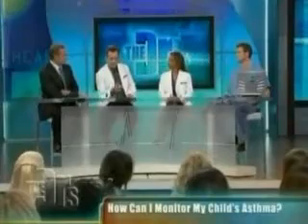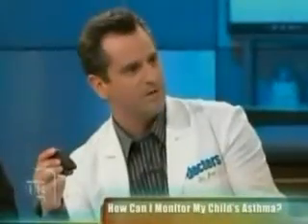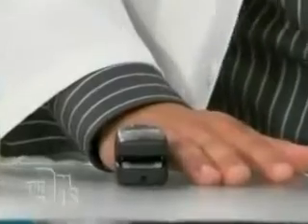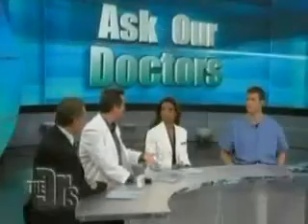This is a pulse oximeter by Devon Medical, but we have big ones of these in our office, a big kind of thing that's on a stand. But this is a little portable one. You basically just slip it on your finger, and it will tell you in just a few seconds how well saturated you are. I'm 99%, which is perfect. And above 90% is pretty good.